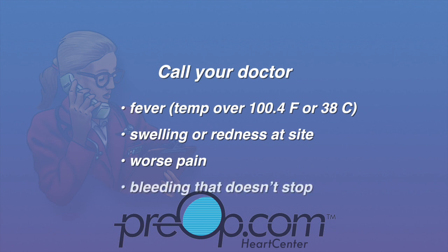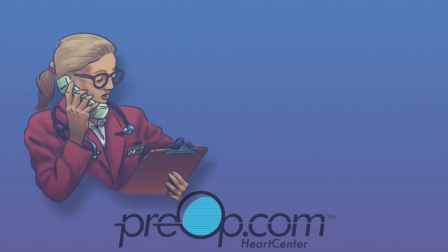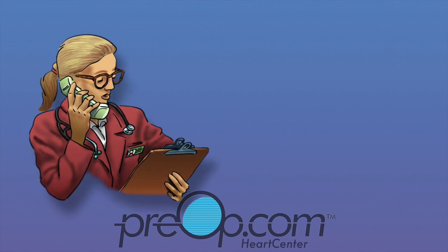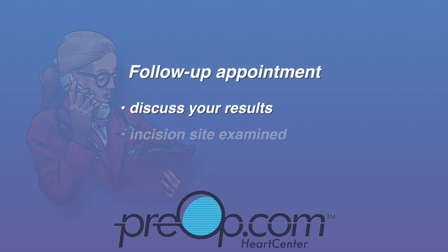pain, or any bleeding that doesn't stop. Hospital admission, medication, or surgery may be needed to fix some problems. You will be scheduled for a follow-up appointment to discuss your results and to have your incision site examined.